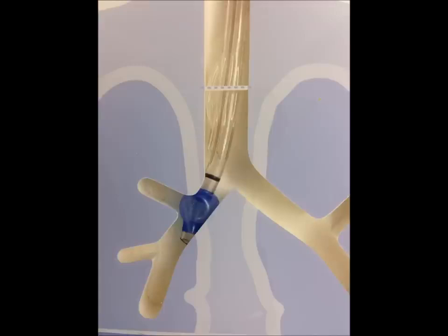Here's an example, just to show you that if you're not careful, this is a left-sided tube. You can see it's small and round. It's not a right-sided tube. But once you get it in place, if there's a lot of twisting of movements and you get disoriented with your bronchoscope, that left-sided endobronchial tube can go down the right side, and then everything's backwards.